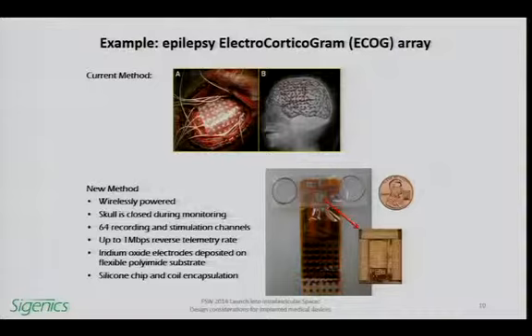Yeah, there's a considerable history of implanted electrodes and electrode arrays, certainly in animals of various sorts, and actually to a large extent in people. So we do try to take lessons from all of that prior experience, of things like hydrogen bubbles. They change the pH and cause all kinds of tissue damage, and that's directly observable in lab experiments. This is certainly an open-ended topic that we could do over drinks. But there's a considerable history in medical devices and biological research that gets us to the point where we are here with this device.